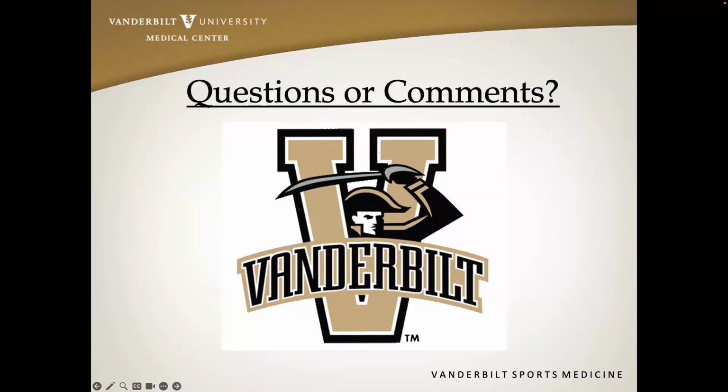My protocol, since we're talking about protocols in this series, is fairly similar. If I'm doing an anterior knee protocol, I do include the retinaculum, the medial patellofemoral ligament, distal retinaculum of the medial side. And I also do include the articular cartilage. Pretty routinely, I include that. And, as I've mentioned before, all my protocols pretty much start with the joint.